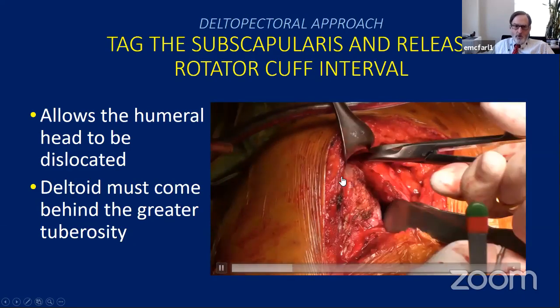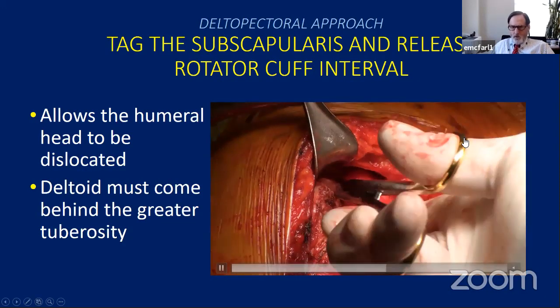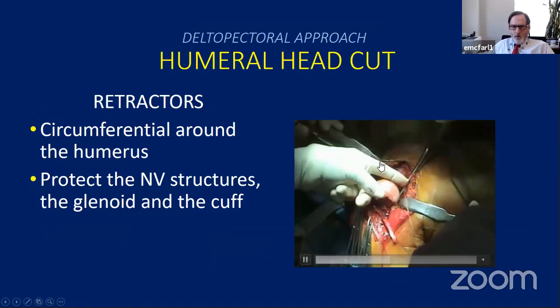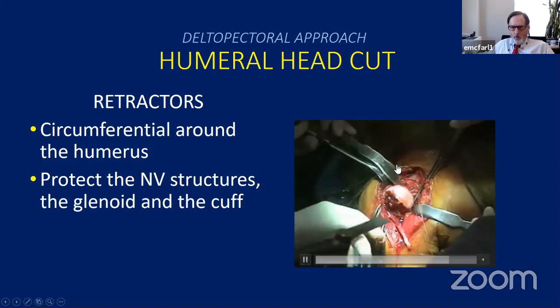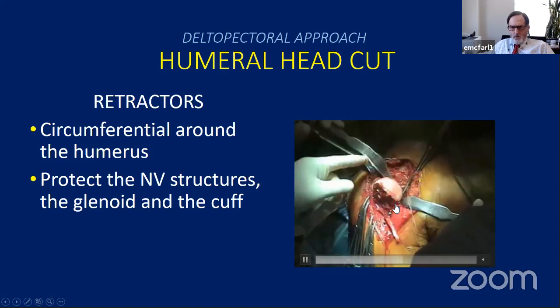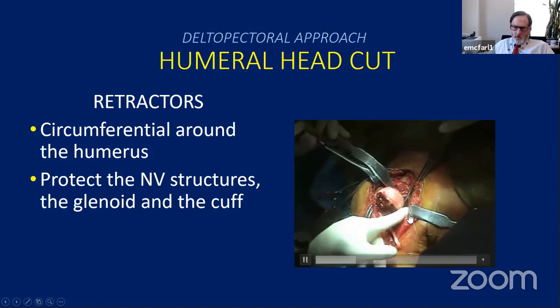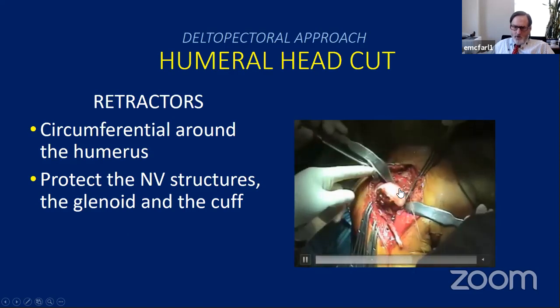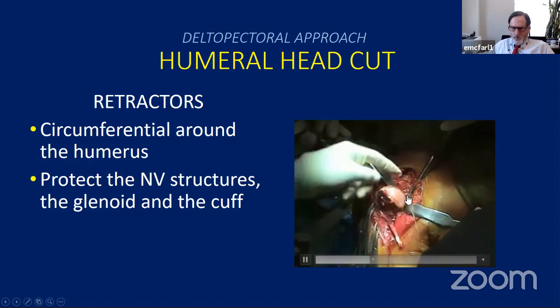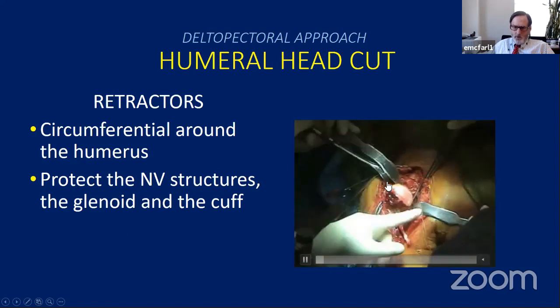So like I said earlier, if they don't have a functioning rotator cuff and you mess up the deltoid, then they're not going to be probably very happy. So as far as making the humeral head cut, I do a little bit of legal work in the United States, and about the only time the axillary artery ever gets cut is right now. And so I always put a retractor inferiorly to protect the brachial plexus. I put something behind the humeral head, so if you do in fact go too deep, you're not going to get all the neurovascular structures. And one up here to protect the deltoid.